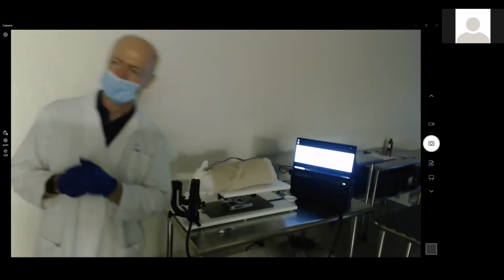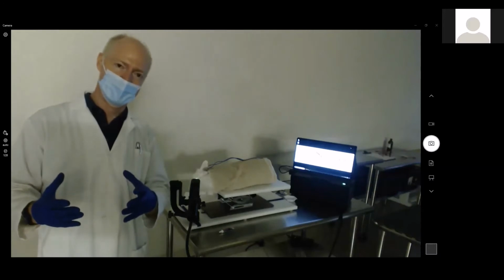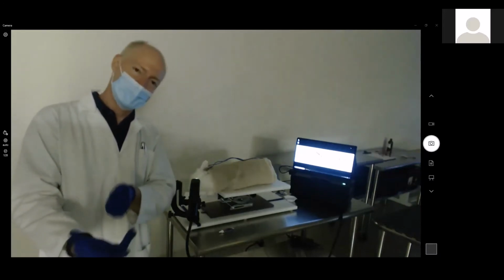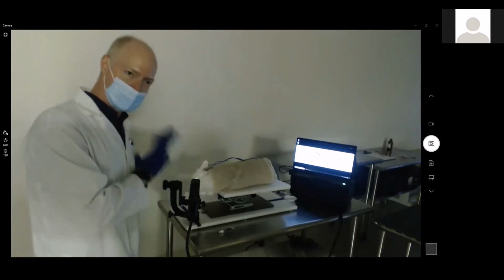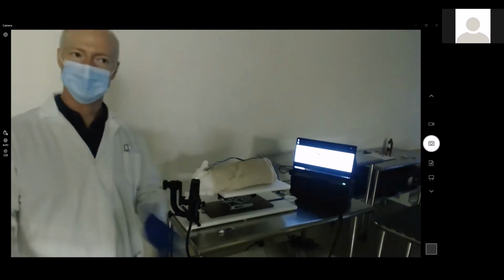The challenge is going to be trying to capture the OCT in the retina, because now you have to deal with a depth component, and now you have to be literally within microns of the right distance away to get a good image, as you've seen when we had the static rabbit. So what I'm going to do here is one more exam.